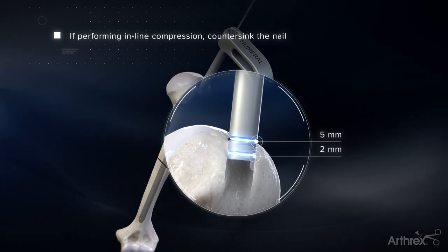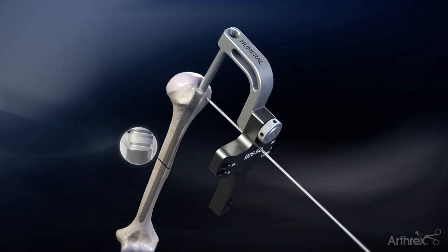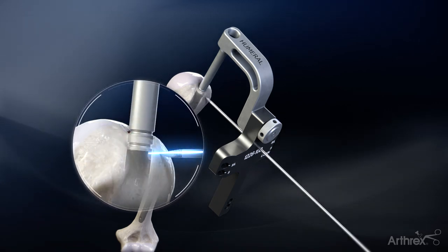If inline compression is used, countersink the nail at least 5mm. A K-wire may also be used through the small hole in the targeting jig to accurately indicate the top of the nail.